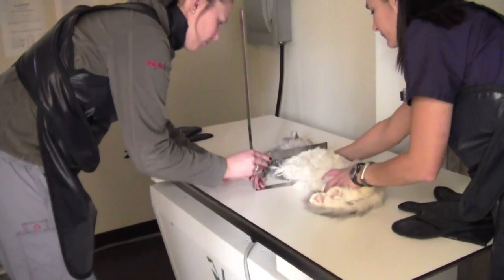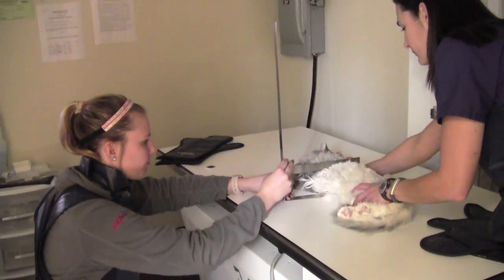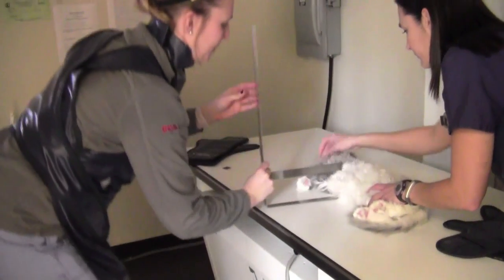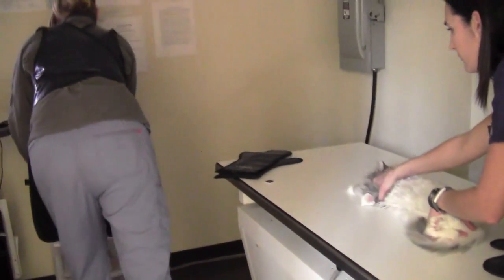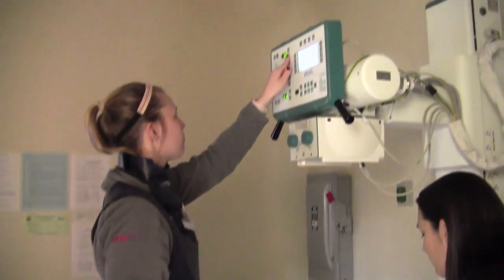I will begin by measuring at the highest point of the patient. Once I have received the measurement, I will use my technique chart to insert the settings on the X-ray machine, and then I will select my collimation.